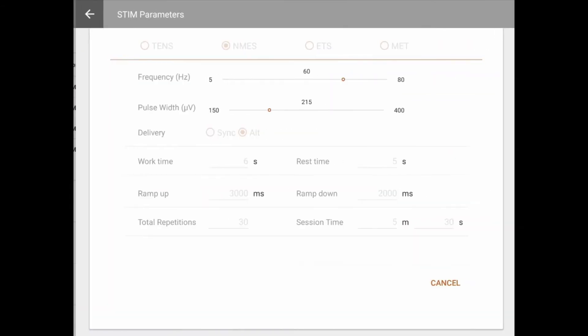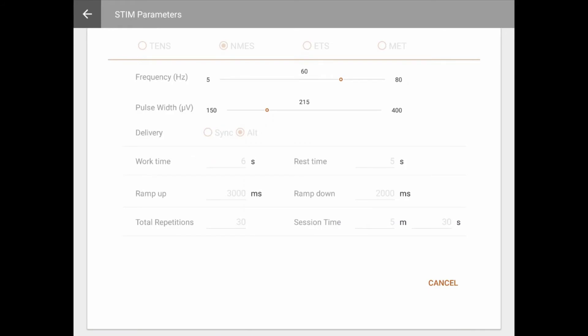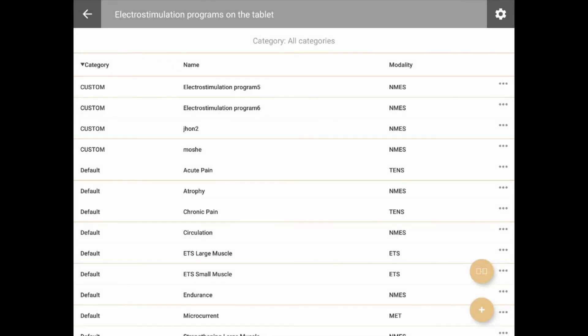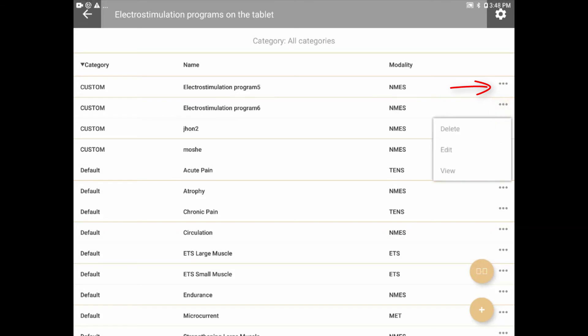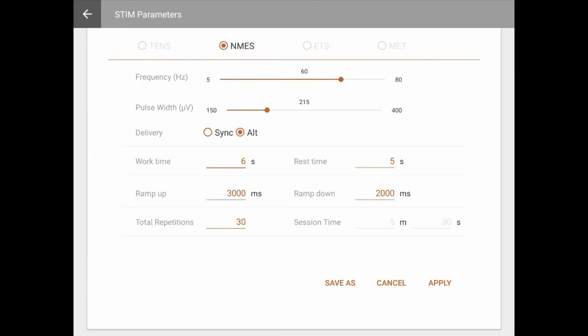Click on the program to view its properties. To edit an existing program, tap the three dots icon on the right of the program to edit, and select Edit. From this menu, you may also delete a program, as long as it's not one of the factory default programs. These cannot be deleted.